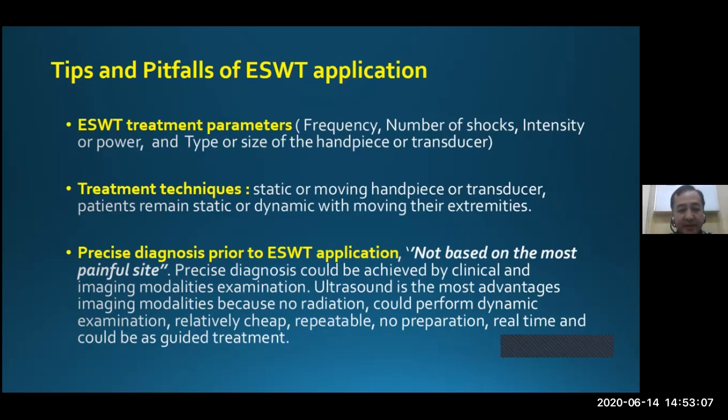And then the treatment technique: static or moving handpiece or transducer? When we treat with shockwave, should it be static or moving? And how about the patient itself? Does the patient remain static, or dynamic with moving extremities?